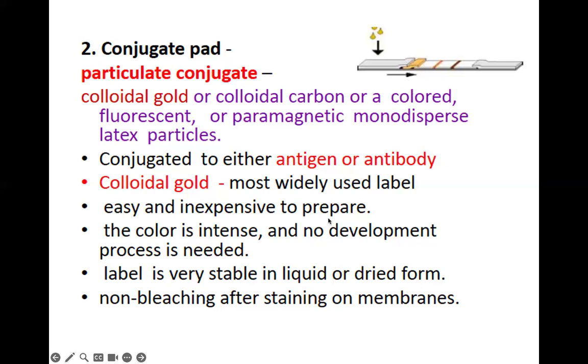immobilized here. How to conjugate the antibody with the gold, you will learn tomorrow. It's a simple chemistry. No need to think about complex chemistry to bind the antibody with the gold nanoparticle.